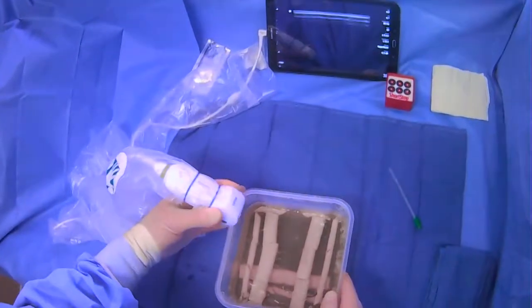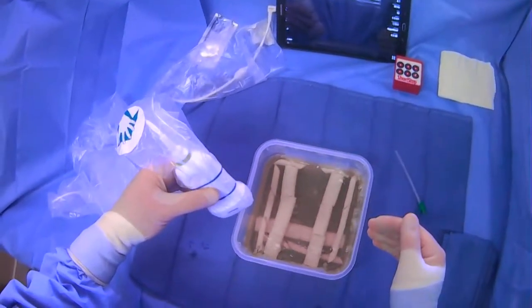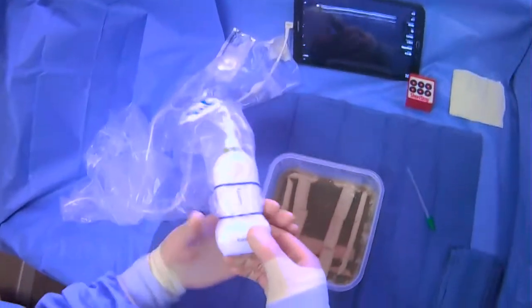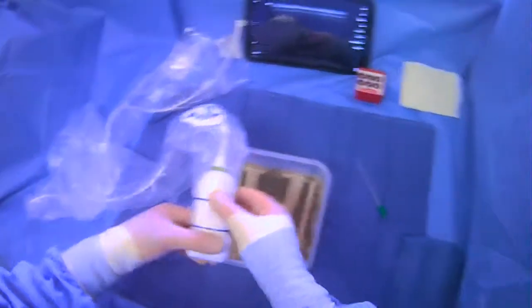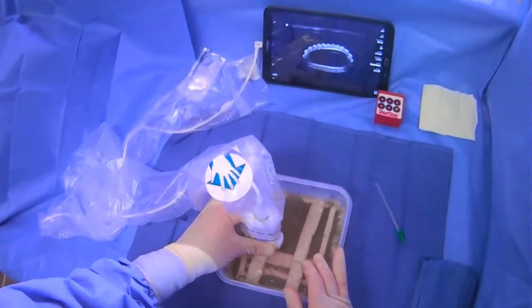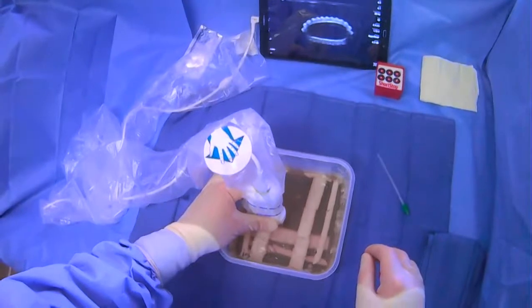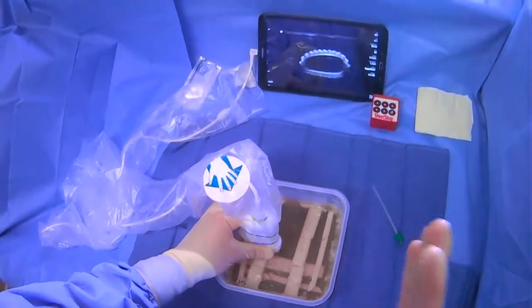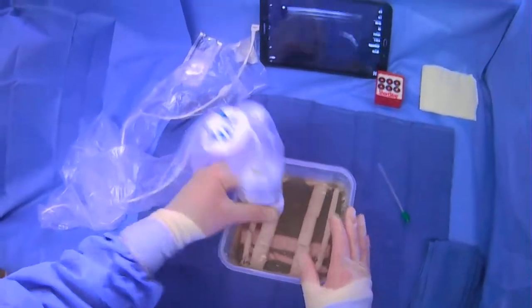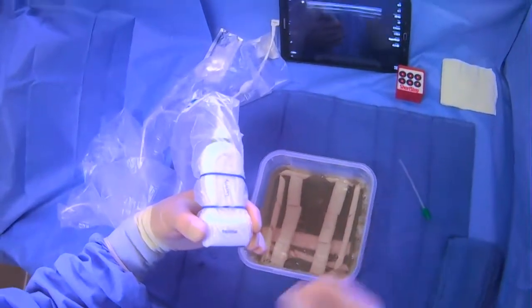So the moral of the story here is that depending on what type of puncture you're doing, if you're going to go long axis or perpendicular to the long axis of the vessel, you want to think about how you're setting up the room, how you're setting up yourself, your machine, and really how you're going to hold the probe and the consequences of how you hold the probe. Ultimately, it's probably best to be comfortable doing it both ways because you may not always be in a position to set up the room the way you'd like to. Or you may have to adjust and think on your feet. So it's important to just understand there are multiple ways to hold the probe, and they have advantages and disadvantages. And really, what you want to maximize is your stability. Make sure that the cord is not obscuring where you're working. And depending on what you're doing, if you can structure things in such a way that your fingers are not between your needle path and where it needs to go, that can also be advantageous.